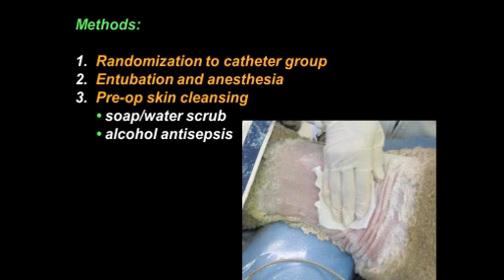The sheep were randomized to catheter group. They were again intubated and put under anesthesia. This time the preoperative skin cleansing is being done with a soap and water scrub, and then we applied alcohol and allowed it to completely dry.